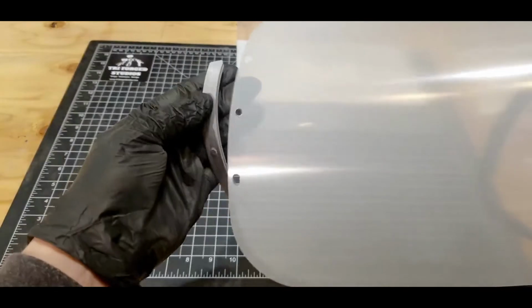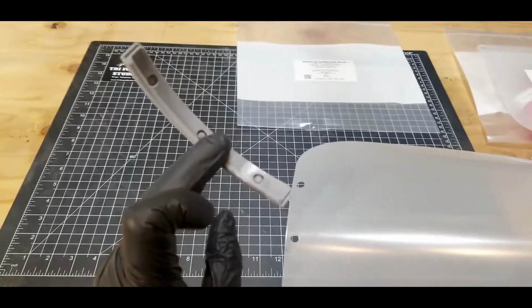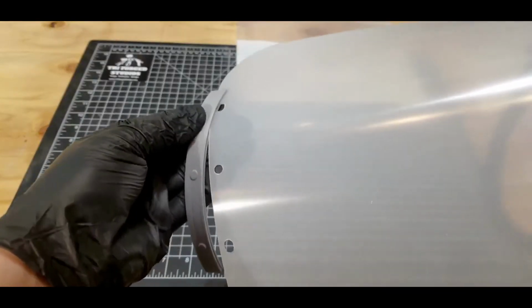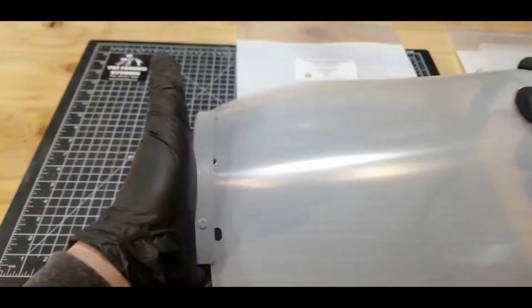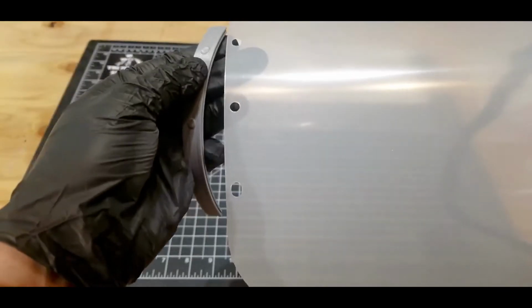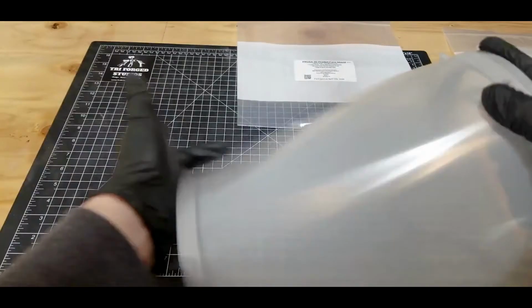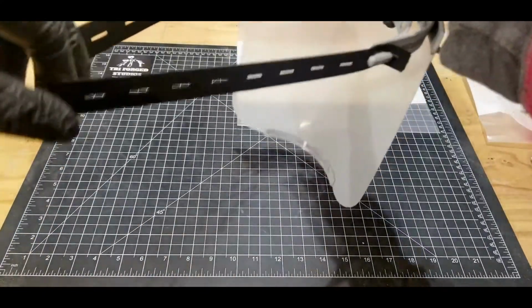Lastly is the chin support. You see that there are three holes there, three holes at the bottom. You just want to line it up as best you can. It doesn't have to be exactly perfect, but if you can, that would be great. Maybe a bit off there, but just kind of get it in place. And there you go. Super easy, adjustable.